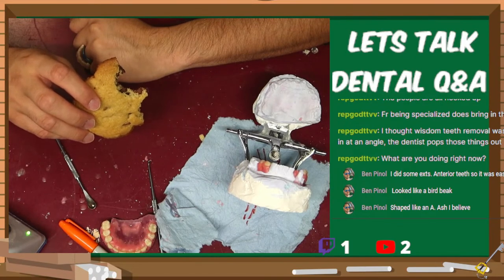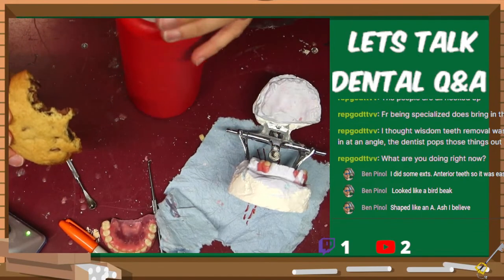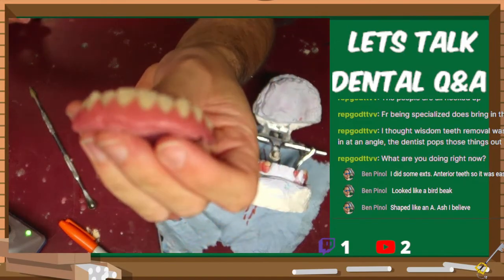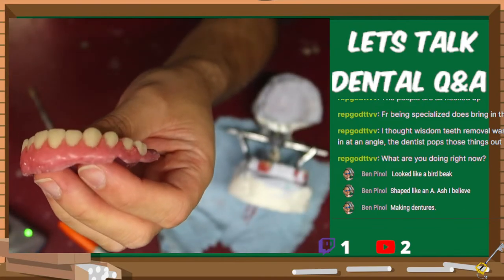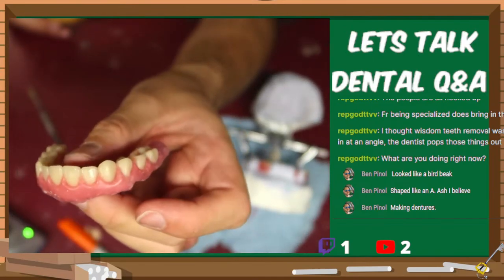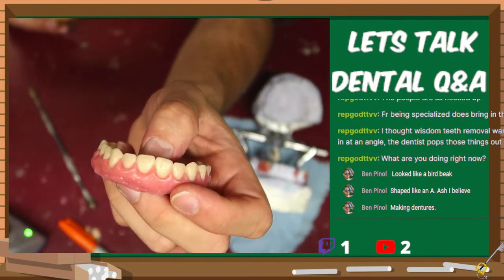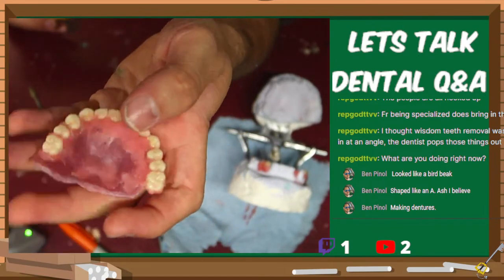What are you doing right now? Apart from eating this cookie and also getting some water, I am making a denture. So I'm making a full denture for these uppers right here. If my camera would focus, maybe I have to tell it to focus. There it goes. Right now I'm making dentures for a patient. And so right now I have just a janky version of the uppers, and this is going to be a try-in denture. They can verify and be like, oh yeah, I like the length, I like the color, I like the gum height. And so that's what I'm doing for the upper. This one's going to be a full one where it replaces all the teeth on the top.